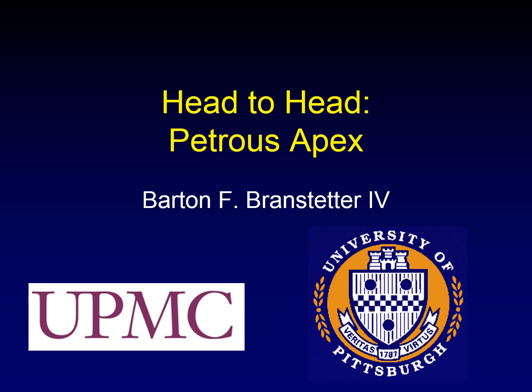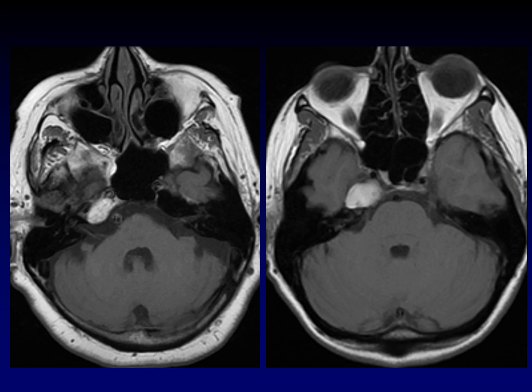In the head-to-head lectures, I show you pictures from two different patients with two different diseases that look somewhat alike. Your job is to pause the video when I'm showing the pictures and see if you can figure out what the two diseases are. Here are two different patients with axial T1-weighted images that show a hyper-intense lesion in the petrous apex. Here's where you should pause the video and see if you can figure out what each of these lesions are. They are two different diseases.